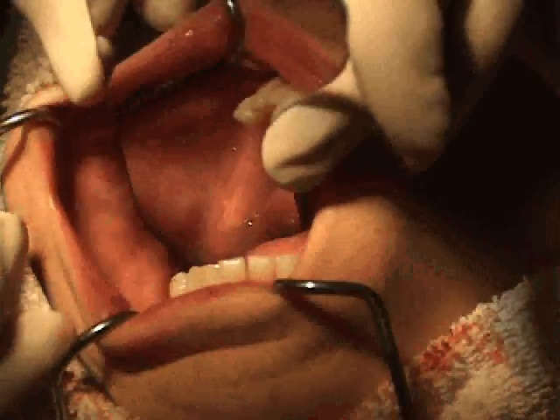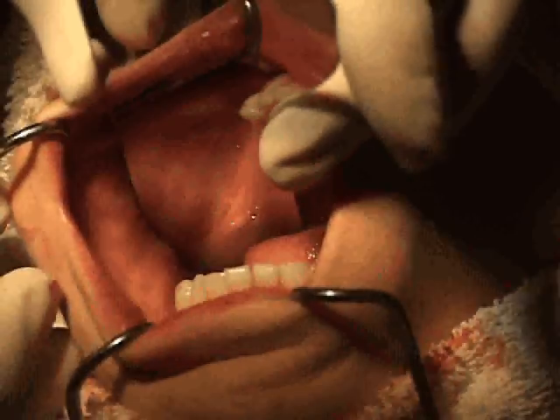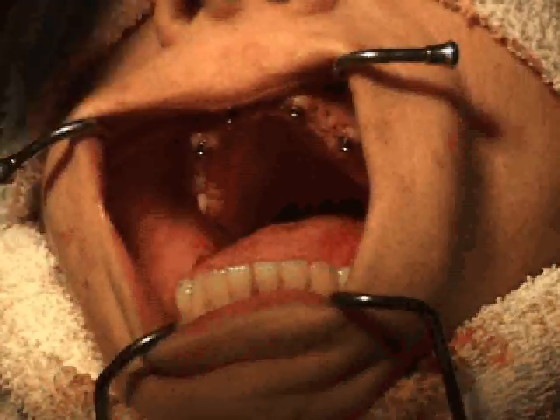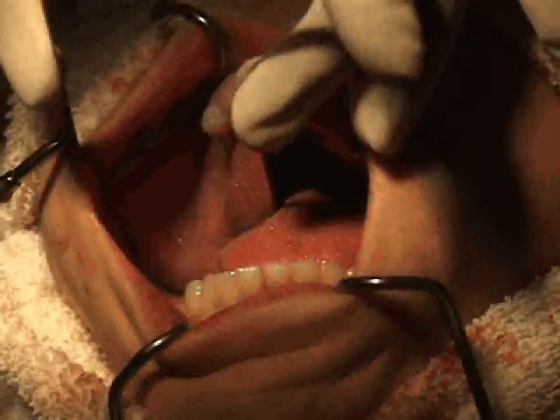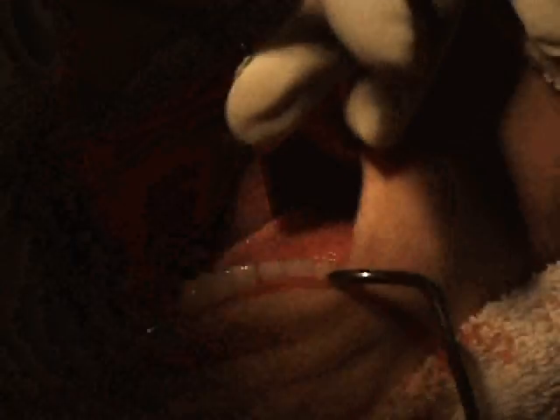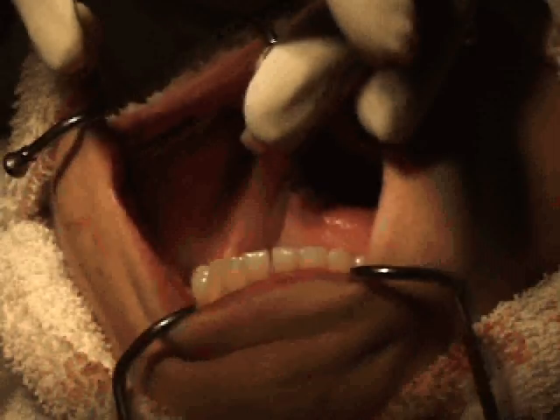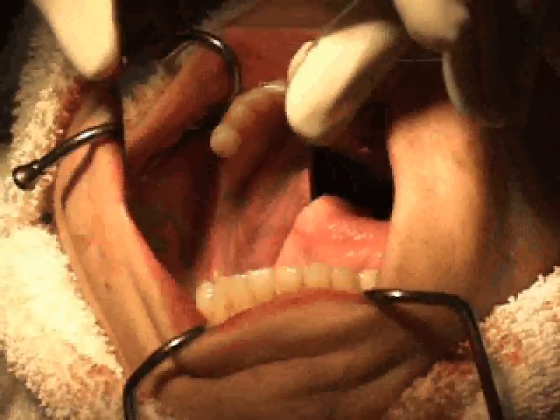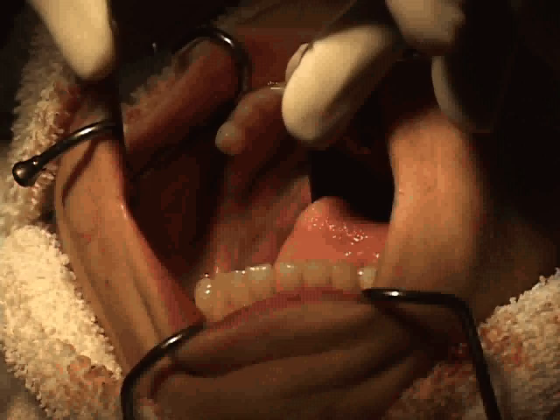The mandibular unilateral custom endosteal implant is one of the most difficult procedures that I've found to photograph. What you see here is a reflection of a very thin mandibular ridge with a mirror. It's very difficult to see, but if you study it, you'll be able to see the very thin ridge. The ridge is directly in the center of the photograph, and it's probably about 8 millimeters from the buccal sulcus to the myohyoid line, and light reflecting right over the top of the ridge so that you can see the top of the ridge with very little connective tissue.